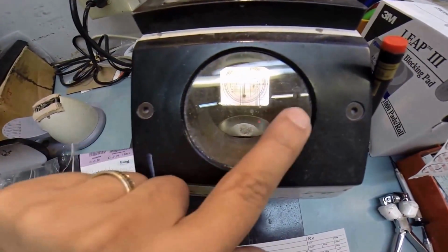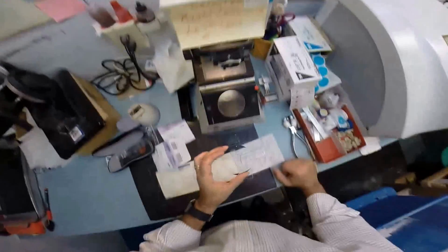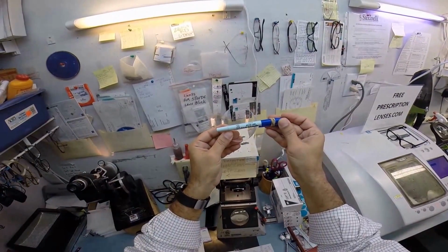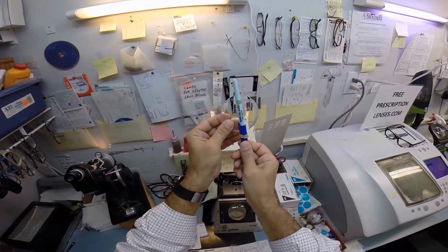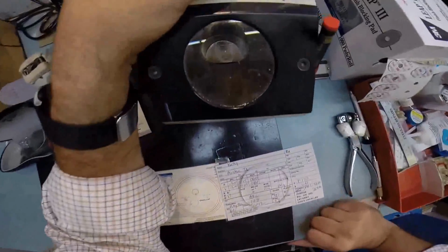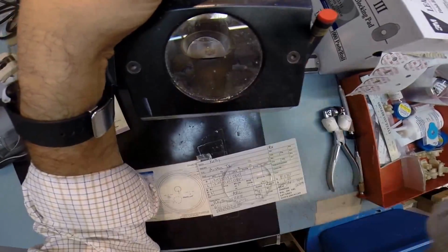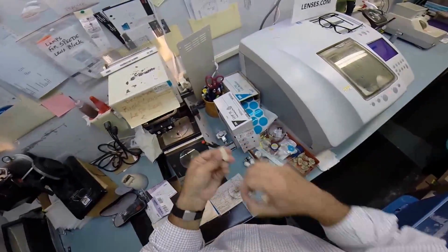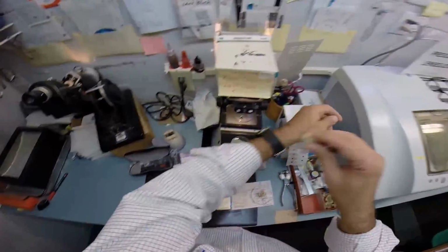I have a vertical meridian and a horizontal one. The reason why I put those 3 dots on there is I want to line up those 3 dots on the horizontal meridian, and then on the vertical meridian it's going to go right through that center one. So let me get everything lined up just perfectly. And I know you can't see what I'm doing, but hey, trust me, that is perfect. I'll do the same thing now for the left lens. Pull that sticker off, dry everything off.